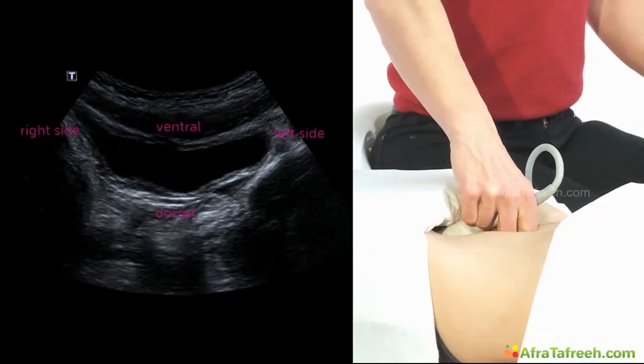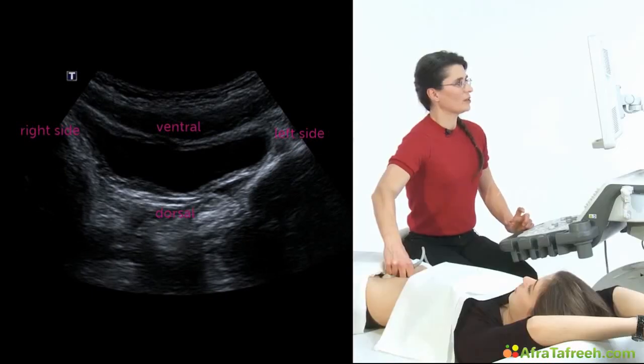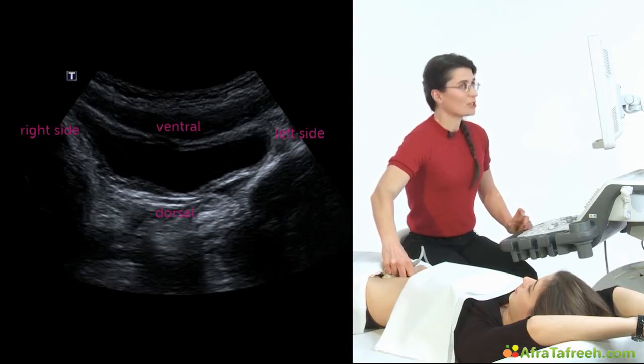And now here we got a beautiful picture of a nearly empty urinary bladder. You see it's quite smaller. The wall is a little bit thicker because it's not so stretched. But the content is black fluid again, and the border is white.